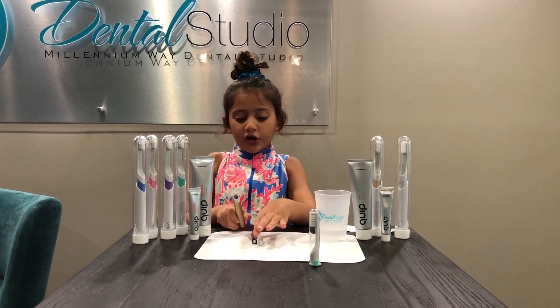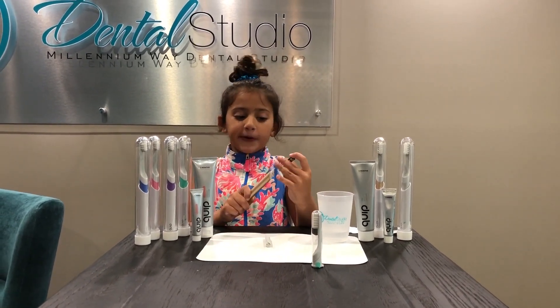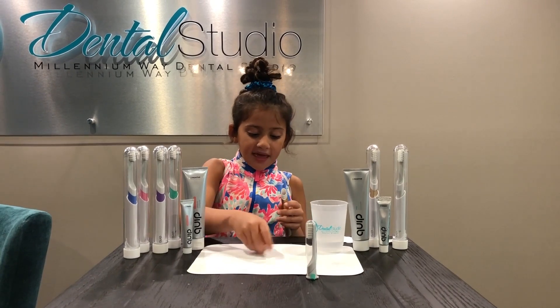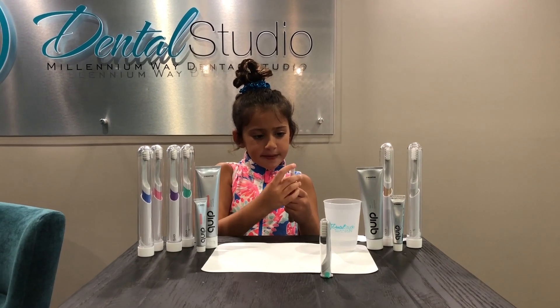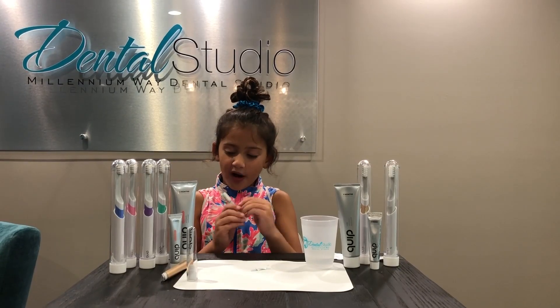Now we are putting our new battery and our motor in. Put it in like this, just slide it back in. Here is your new one.